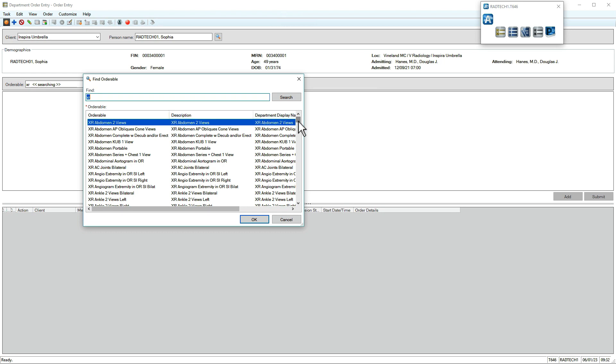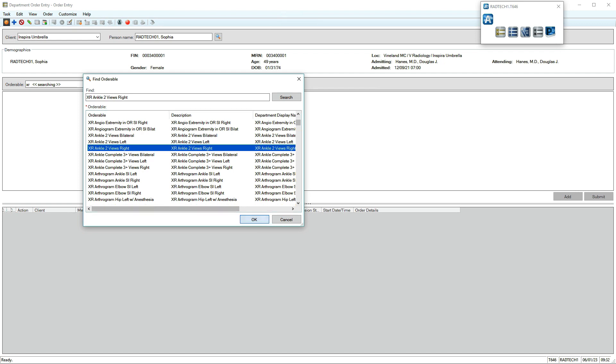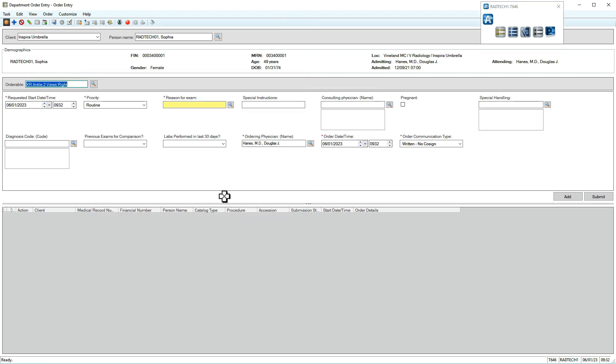Scroll if needed, make a selection, then click OK. Order details display. Required fields are highlighted yellow or include a red asterisk in the title.